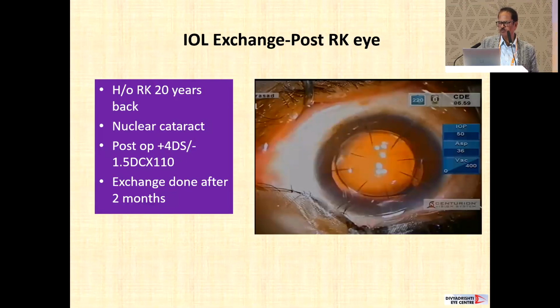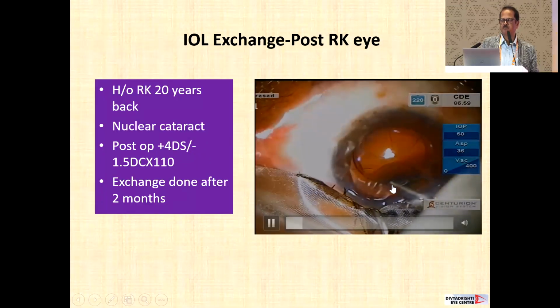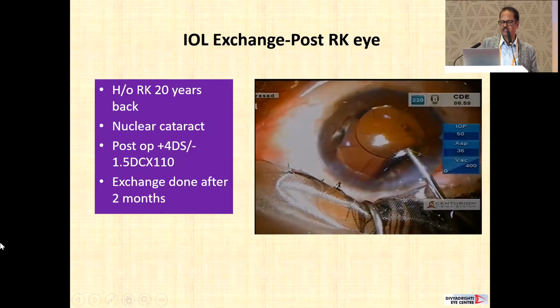So in those patients, you may not like to put that lens. This is one small video clip, quite old, more than 20 years old. This was my first RK patient who had developed cataract and came to me, and I did not have much idea how to deal with these patients, so I landed with a refractive surprise.